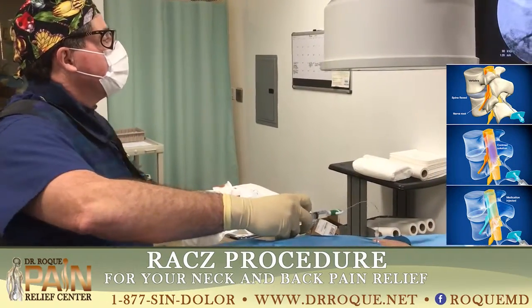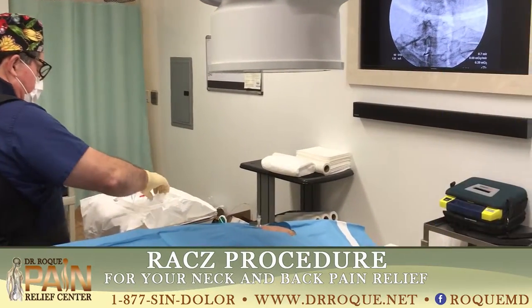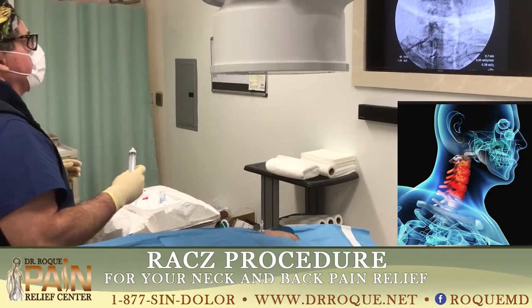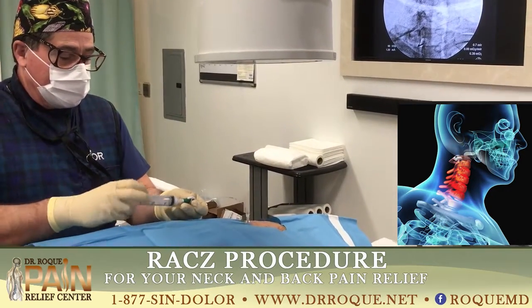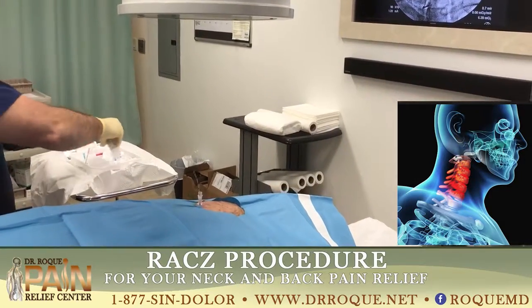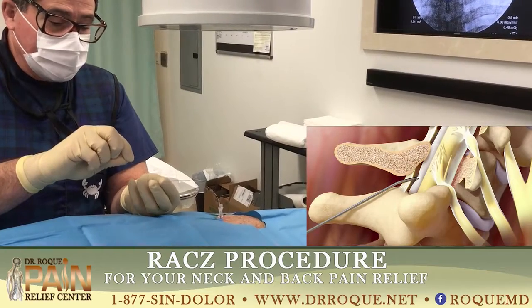I'm going to stop here. You okay, Gary? Yeah, okay. I'm going to tell you what's happening, friend. I'll tell you in a minute. Now the little pressure — that's the good news, that it's going down the wrist.